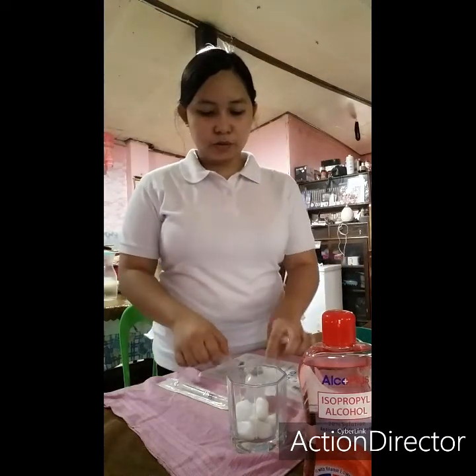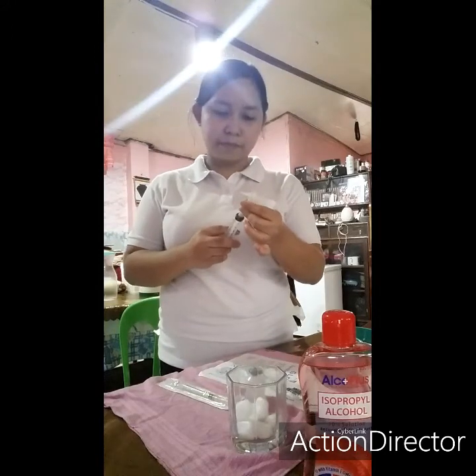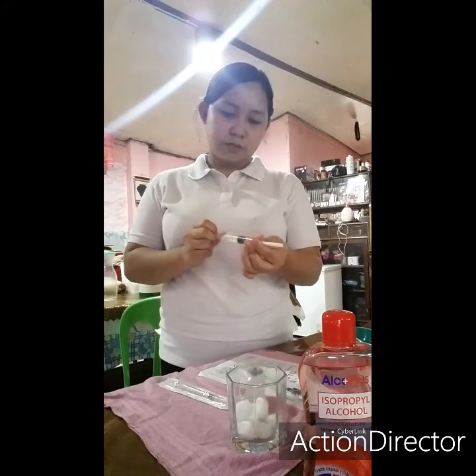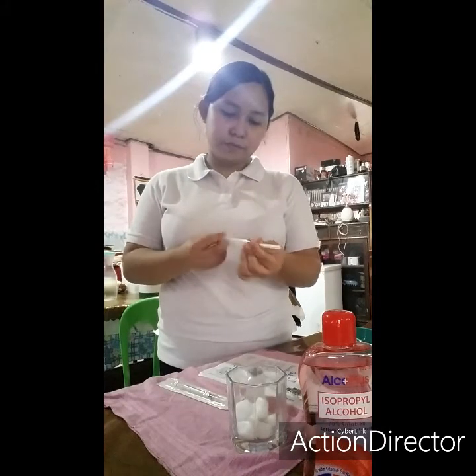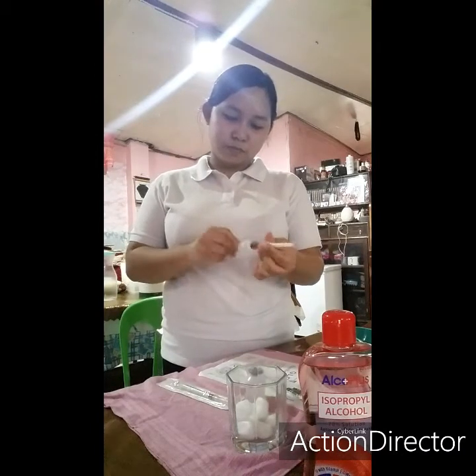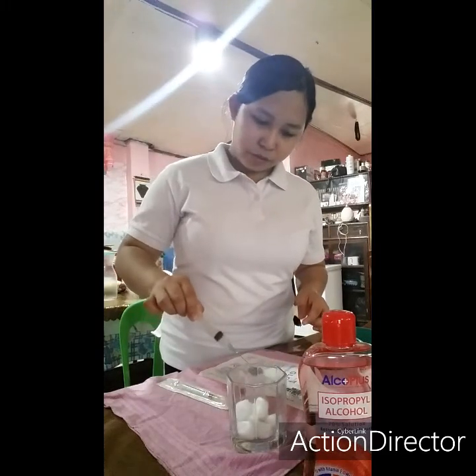And now, aspirate the medication. Uncap. Check and loosen the plunger. Then put 2 ml of air inside the syringe. Then uncap and inject the air into the vial.